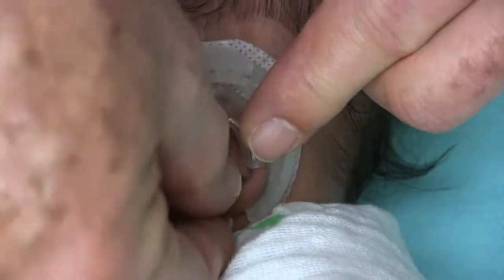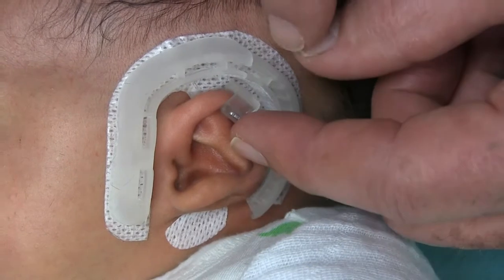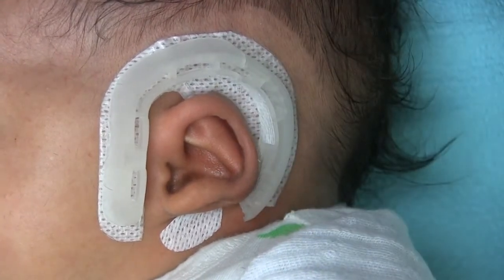In him it just feels like it's pinched in. I think I'm going to go with that. I think we're going to get this ready for you. Alright, let's do it. We're rolling.